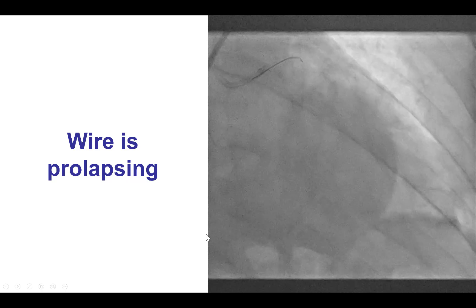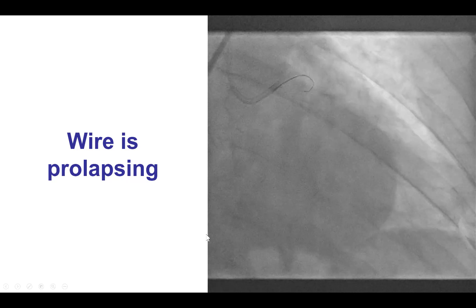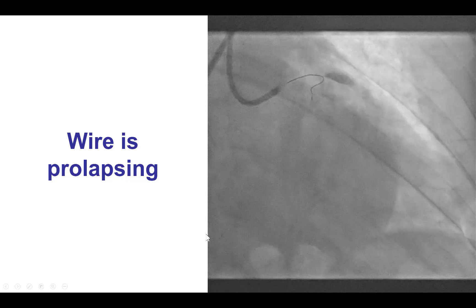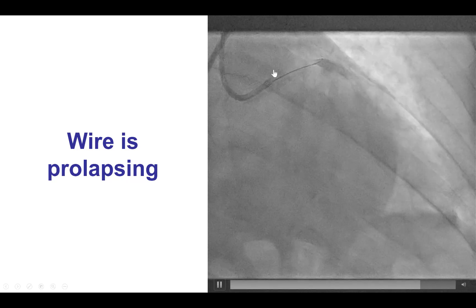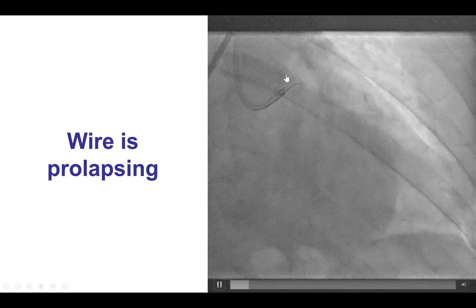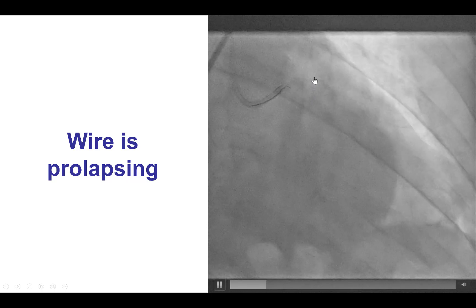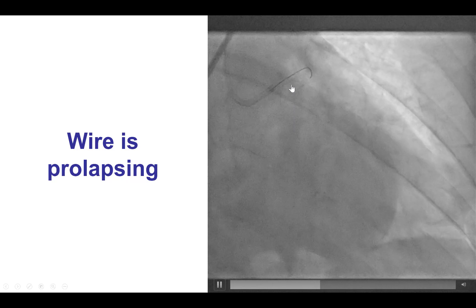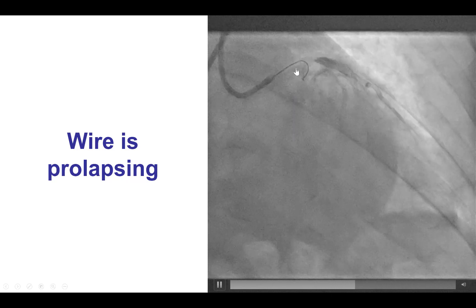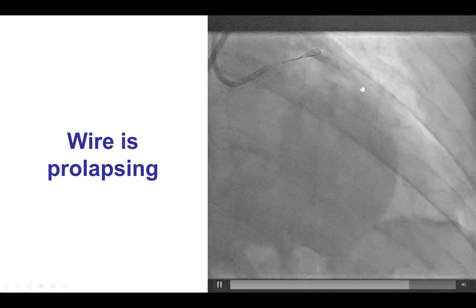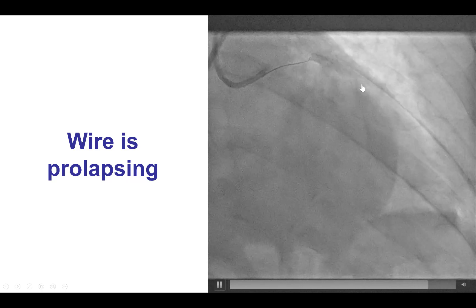Before doing stenting, however, we have to advance wires across the lesion, and this is one of the challenges of the case. There is significant tortuosity — a more than 90-degree angle to go from the left main into the circumflex — and one of the potential problems when trying to advance wires through these bends is that the wire tends to prolapse into the main vessel.